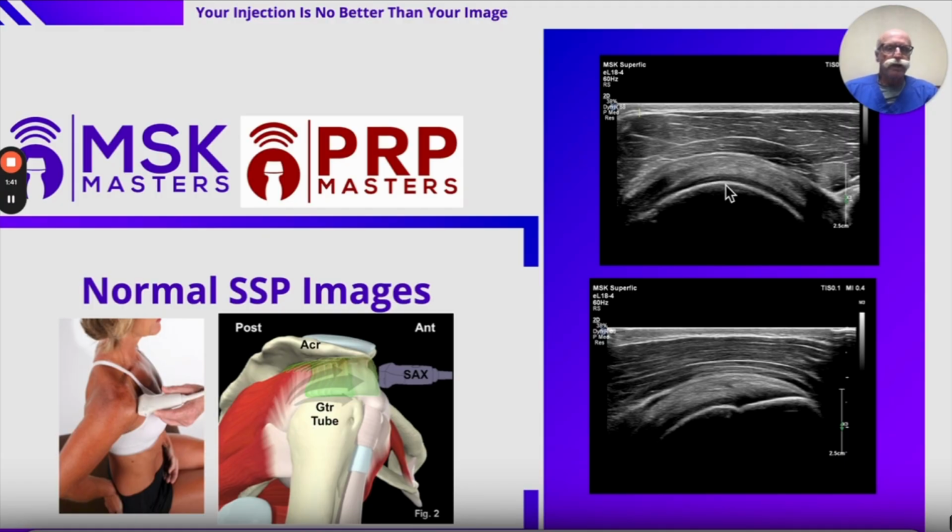But this is the humeral head, this is the hyaline cartilage, and from here to here is the uniform, homogeneous presentation of the hyperechoic supraspinatus tendon in short axis probe orientation. The bottom image is the long axis view of the supraspinatus insertion onto the greater tuberosity.